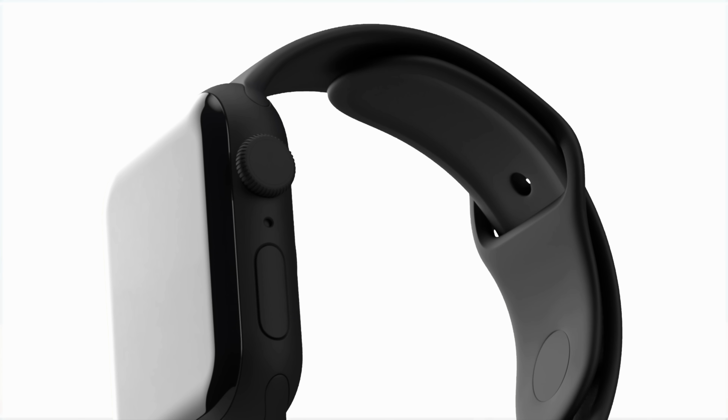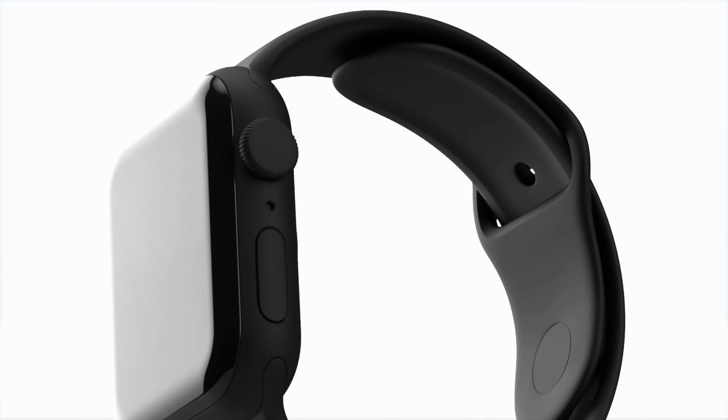So that's Holter monitoring. And I guess for the really infrequent stuff, there are devices available. Apple Watches, for instance, and something commercially available called Kardia. Here in Canada, it's about $100 off of Amazon. They're fantastic, single channel medical grade ECGs. So for something that you have infrequently, you can capture your own ECG. And we do have patients do that.